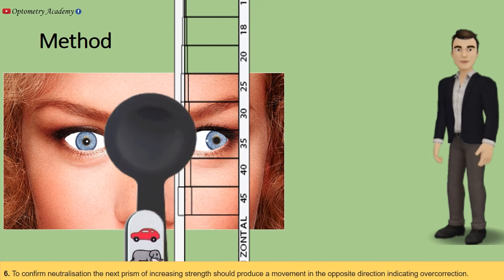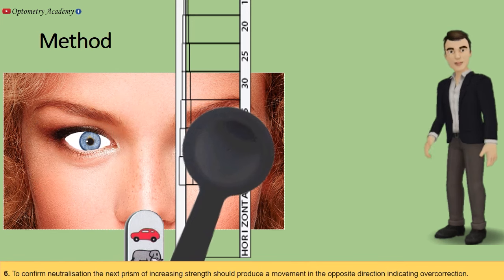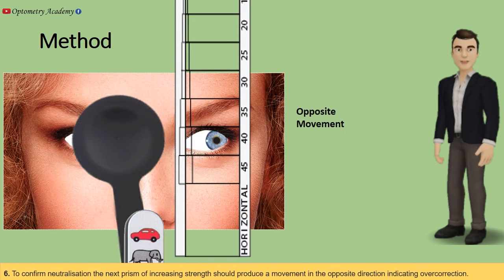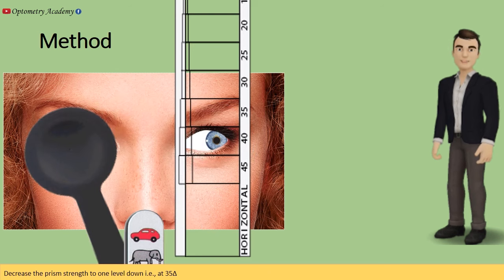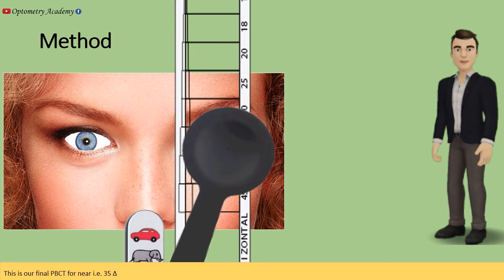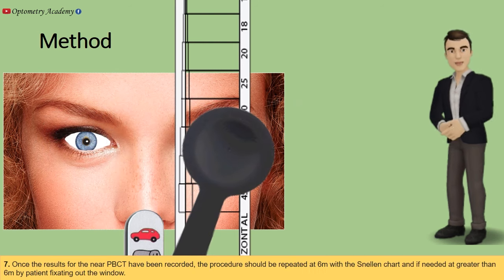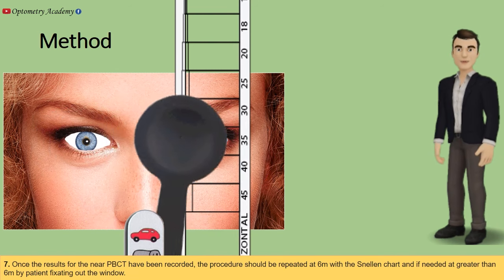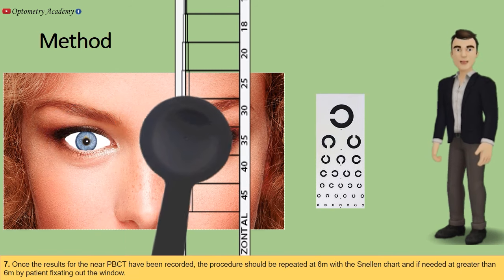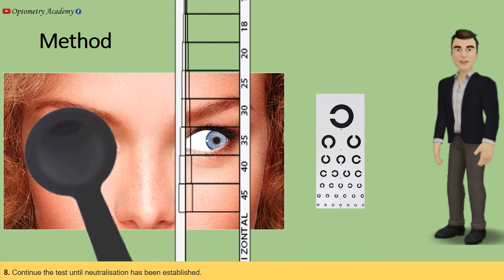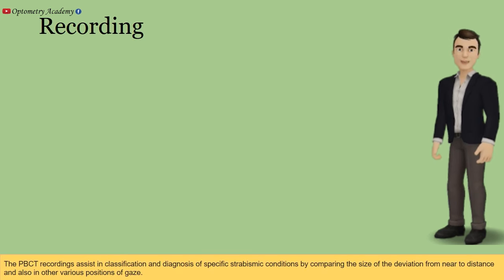To confirm neutralization, the next prism of increasing strength should produce a movement in the opposite direction, indicating over-correction. Decrease the prism strength to one level down — in this example, 35 prism diopters — which is our final PBCT result for near: 35 prism base in. Once the results for the near PBCT have been recorded, the procedure should be repeated at 6 meters with the Snellen chart, and if needed at greater than 6 meters by having the patient fixate out the window. Continue the test until neutralization has been established.